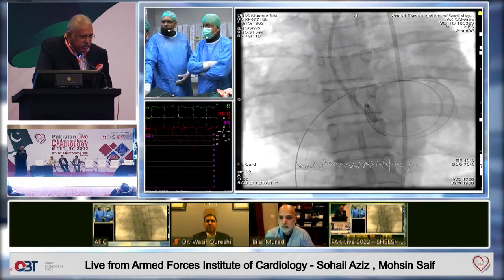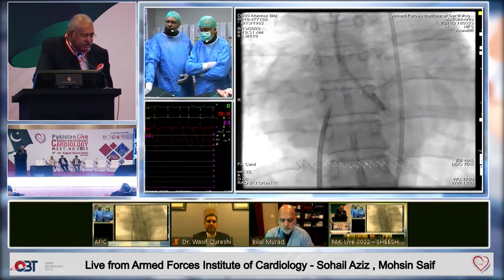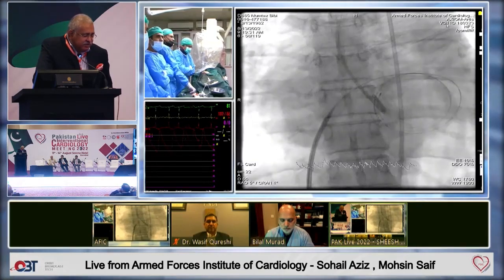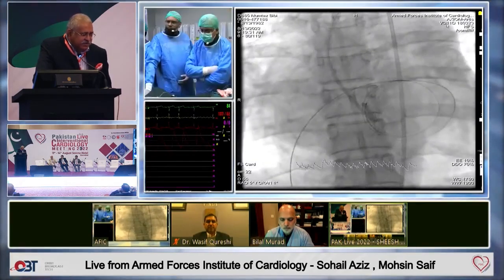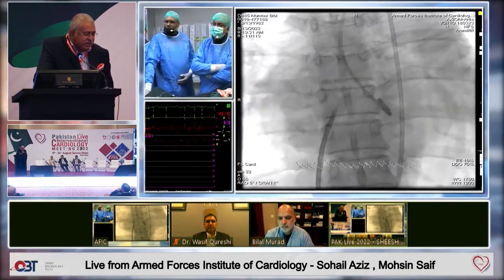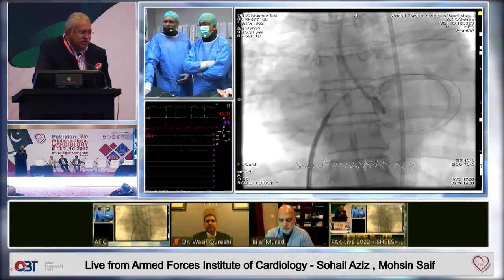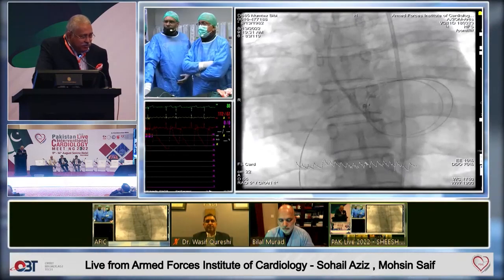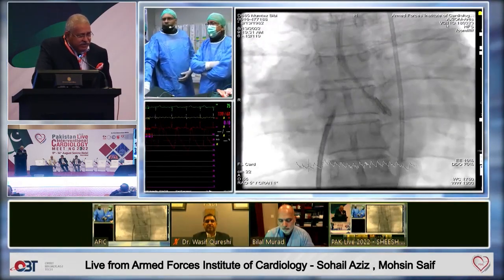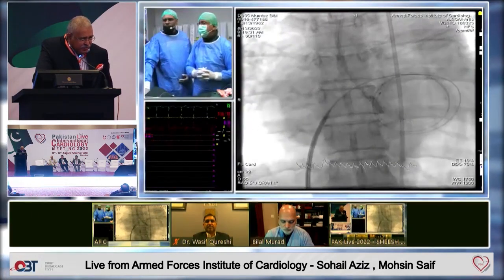We do this puncture 100% of the time in our mitral cases, but these punctures in AP view are done by our EP colleagues routinely. So we have the opportunity of seeing their puncturing technique, and hopefully now we will try to learn that technique also. But routinely we do AP and lateral for superior, inferior, anterior, posterior landmarks. The two-lateral view is what Alan Review also practices.